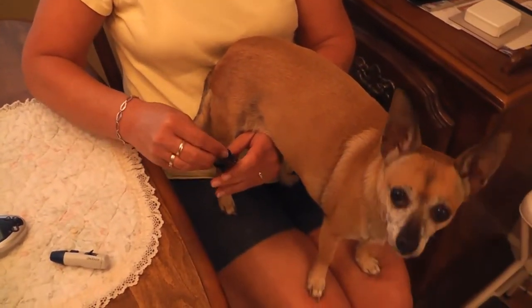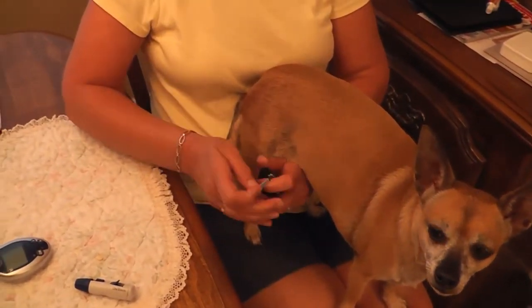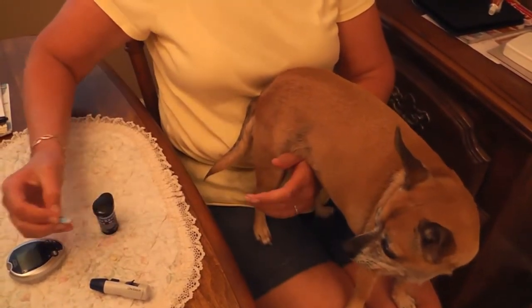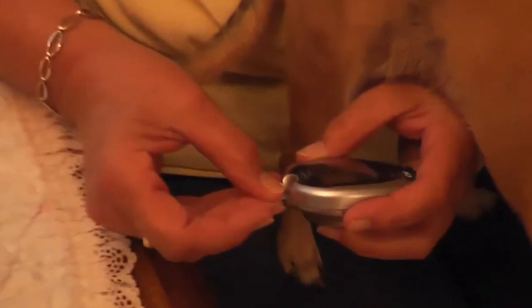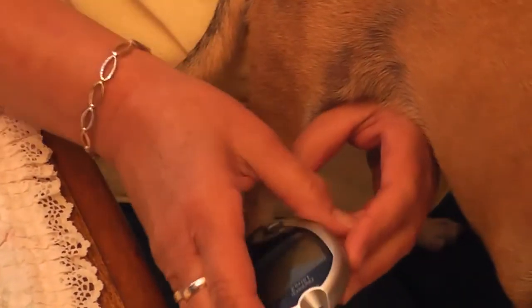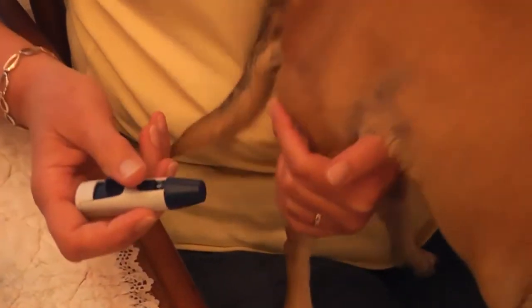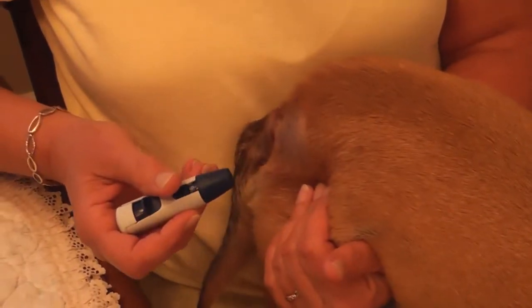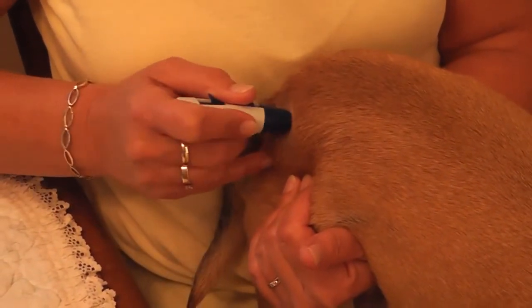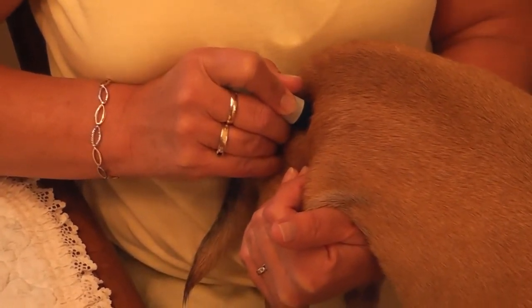Put a strip in the meter. Good girl. Engage the clicker — I support her underneath and kind of pull the skin a little tight. Press real firmly and click it, then hold it down.